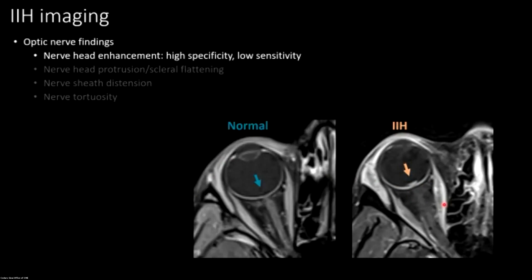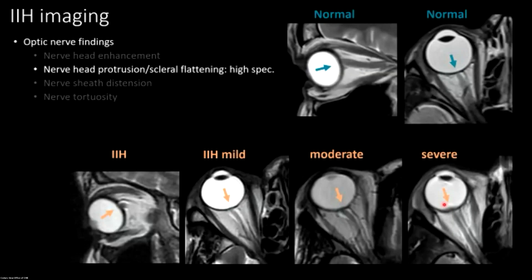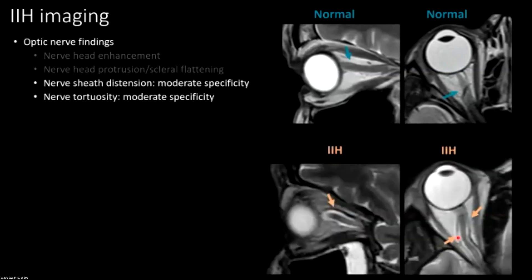Of the same degree of specificity — around 95% — is protrusion of the optic nerve head without enhancement, either because contrast wasn't given or it just didn't enhance. It's often helpful to look on the sagittal image; sometimes you see these findings much better there than on axial. Every MRI done for headache, I'm looking for this. Here's optic nerve head protrusion on sagittal and axial views — even just a little bit of flattening with a bunch of other findings pushes me toward suggesting IIH. The nerve sheath can also distend and become tortuous — you want a relatively straight nerve without excess CSF around it.